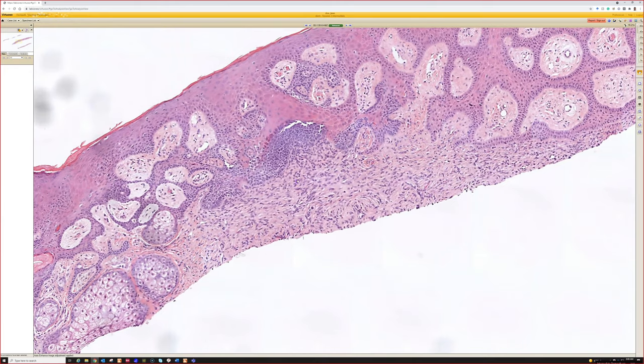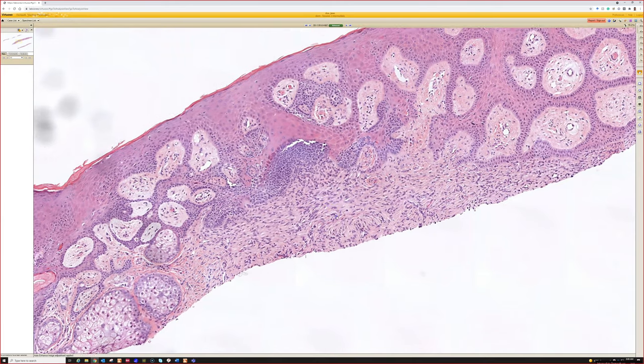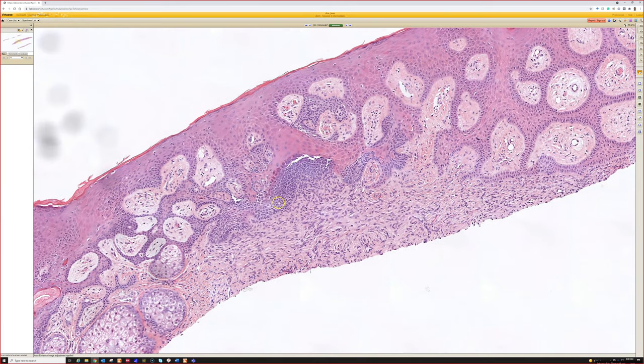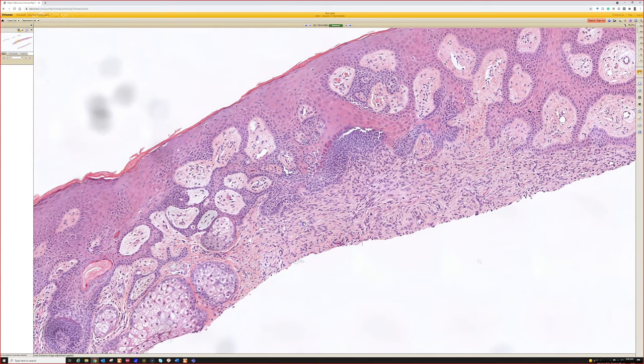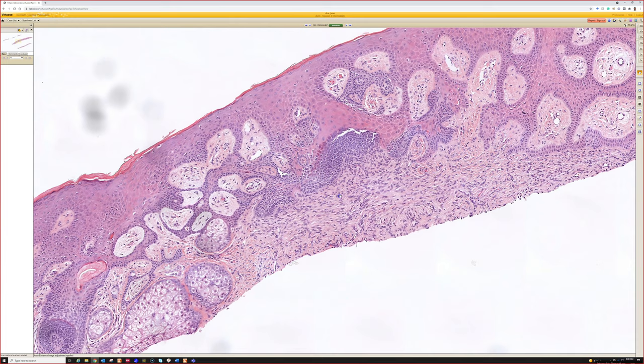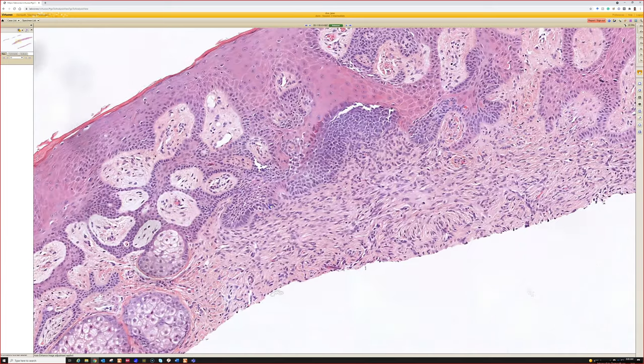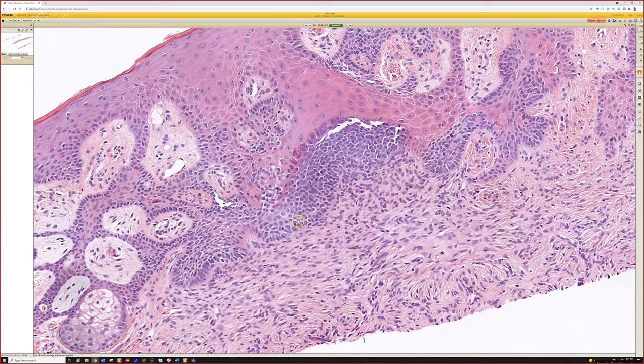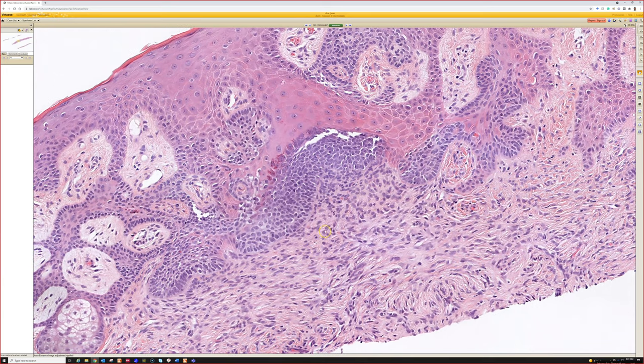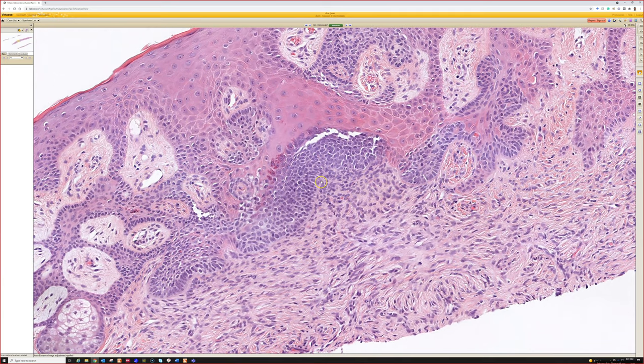The trick is that this can look like basal cell carcinoma. Usually it does not have clefting - that's one clue that helps tell that this is hair follicle. These are basically the roots of hair follicle growing here, and you can see it's even got a little bit of a papillary mesenchymal body.